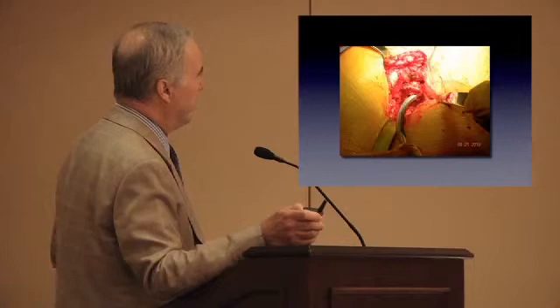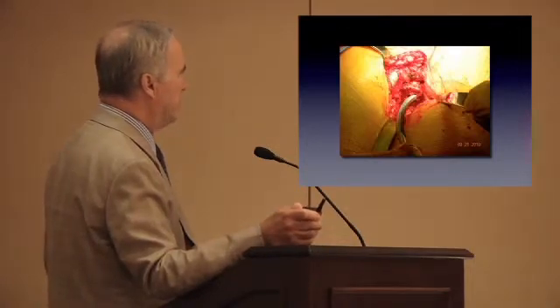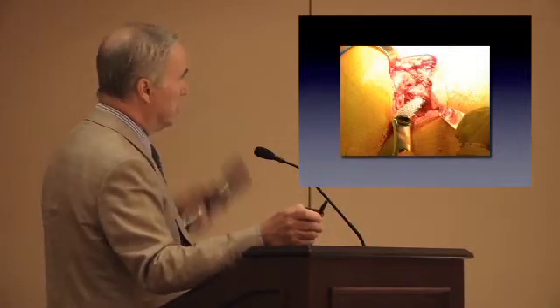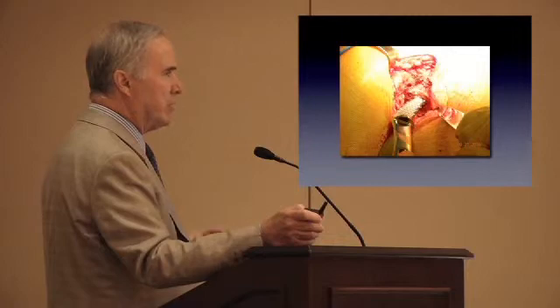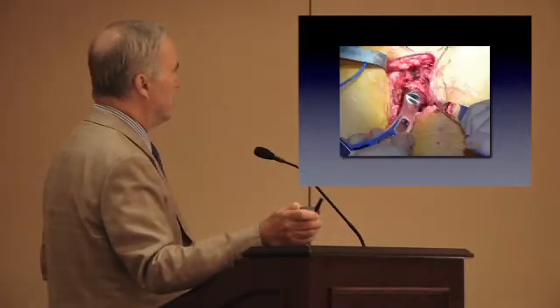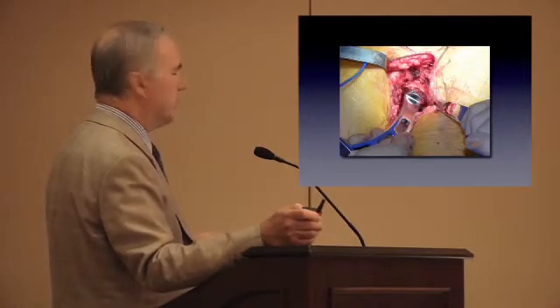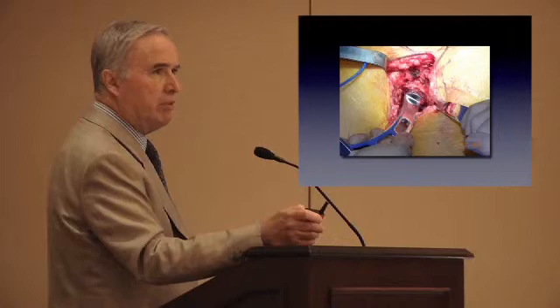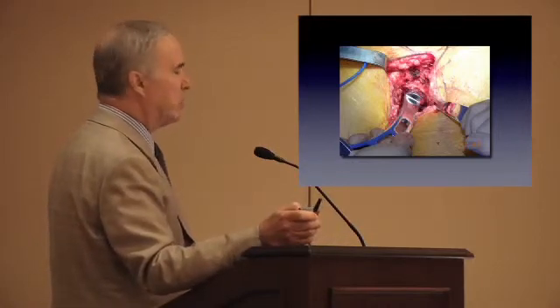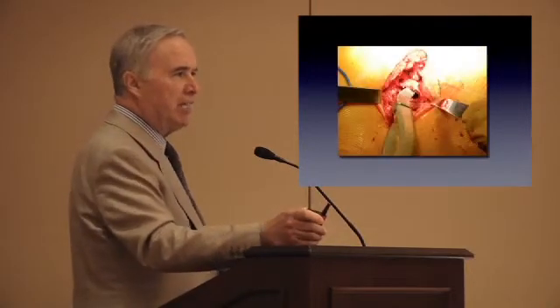once we've identified the canal with the curette and the rat-tailed rasp, then I use the Mueller rasp, which is really a nice device. It's got the right amount of aggressive teeth to it, and then you can check your neck cut with that to see if it's accurate or not. You can make a small adjustment if you need to, just for aesthetic purposes. And then that's followed by the implant-specific rasps.